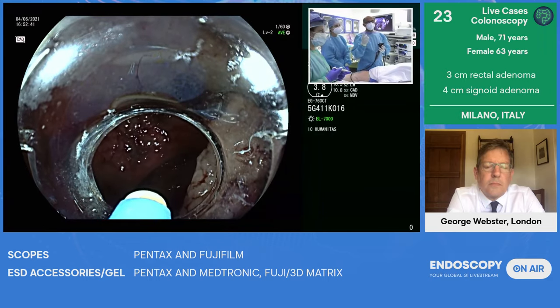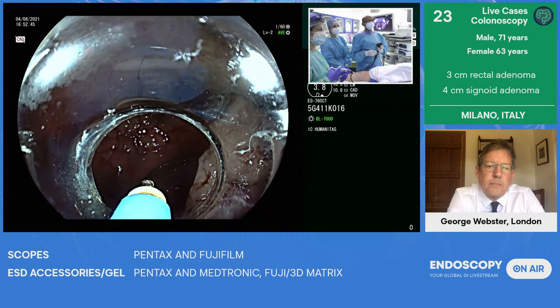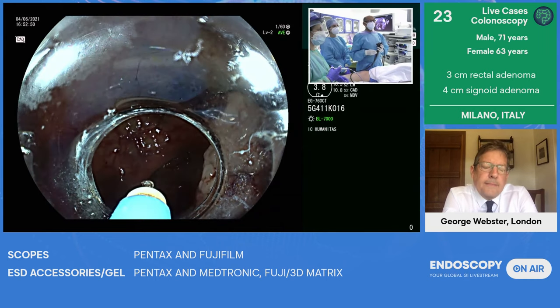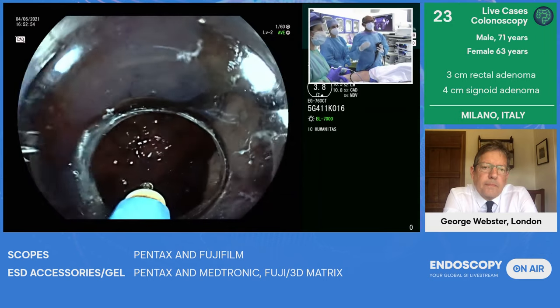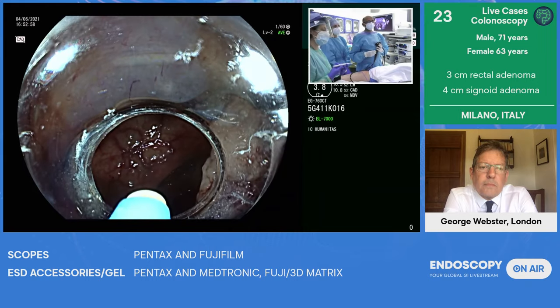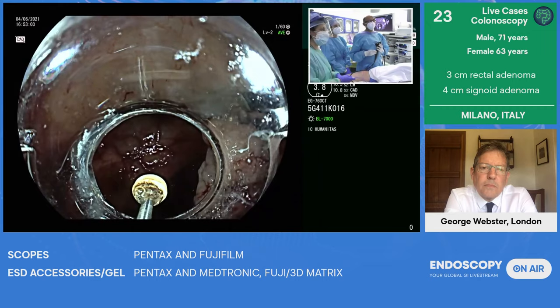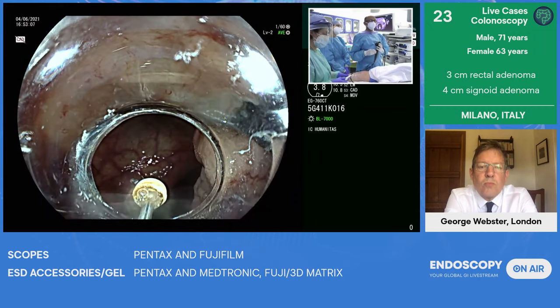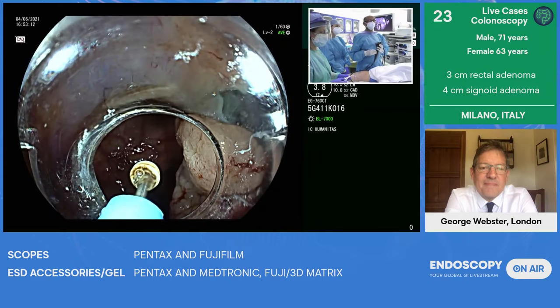If we show the needle type knife first, please. You see, it's a needle type knife, very much like the flush knife and dual knife. But when I'm doing blind dissection, I want protection against the muscle. So we want the IT type, the ball type knife now. And it switches over to a new knife. So I've got two in one, George. We love deals, so this is the best deal. You get two in one knives here, and I can switch between either of them as I want.